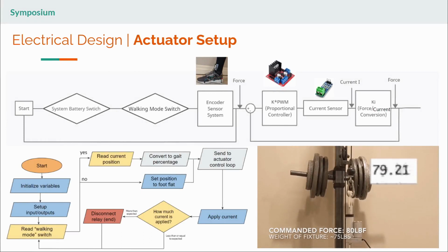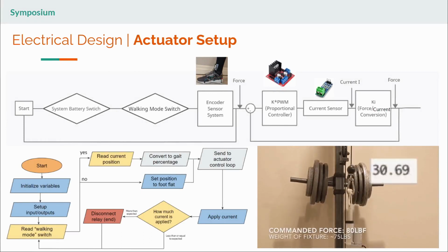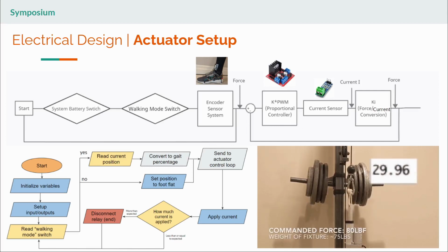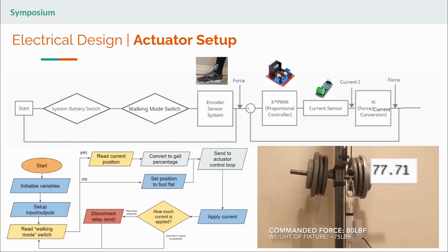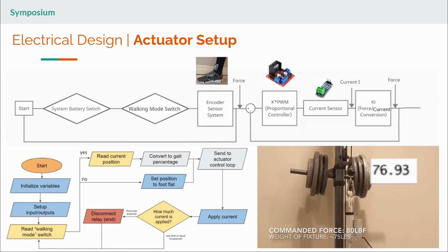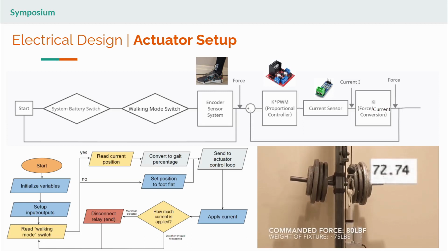In order to actually assist the user with walking, the following control loop was set up. A variety of end stops and limit switches were implemented to ensure user safety throughout this entire process, which begins with reading the gait position from the sensors. This value is then converted to a related force, which is verified through our current control system. If at any time we detect there is an unsafe amount of current or force in the system, we immediately stop any actuation. Otherwise, the actuator continues pulling or pushing until the next gait position is detected, where the cycle then repeats itself until the user decides to stop.